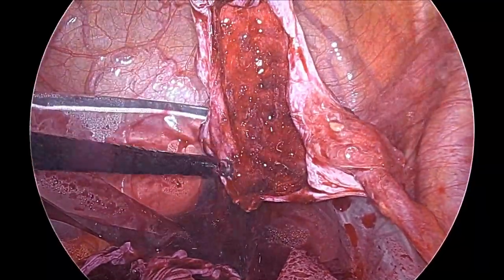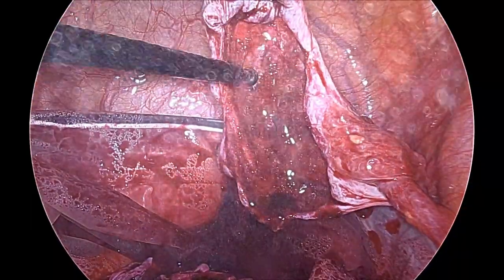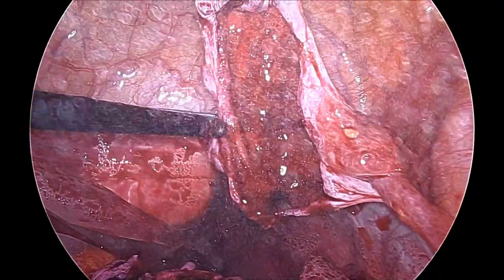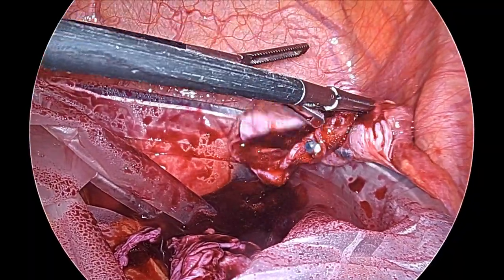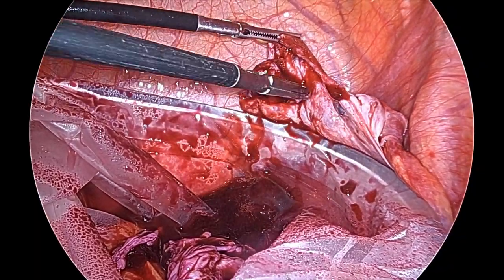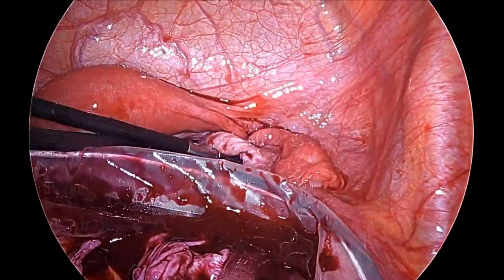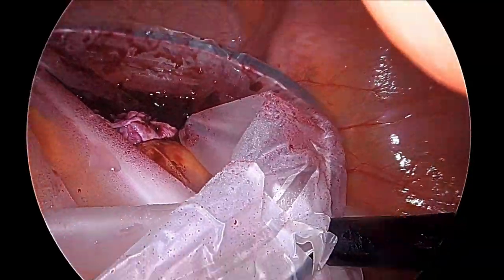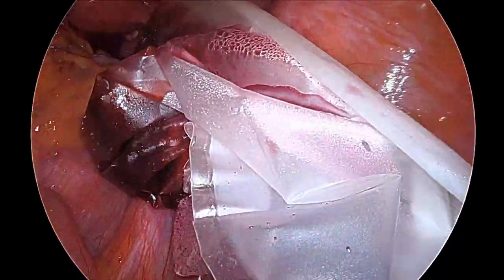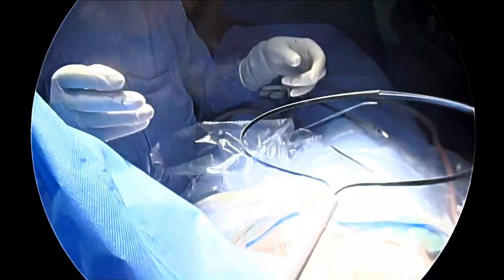If there is bleeding you can also suture, or perform marsupialization on the margin. The harmonic ball is preferable for inner fulguration in our practice. Now we catch both edges of the ovary and carefully invert the margins into the ovarian fossa, then drop the ovary in. Pulling the endobag away from the ovarian fossa, the specimen is dropped in. The endobag is closed, the metal ring comes out, followed by the purse string.